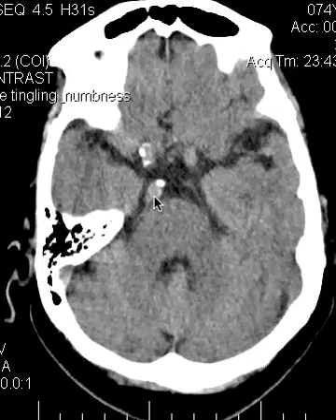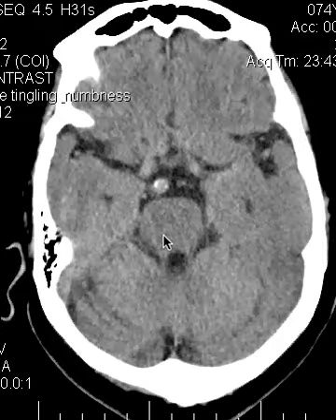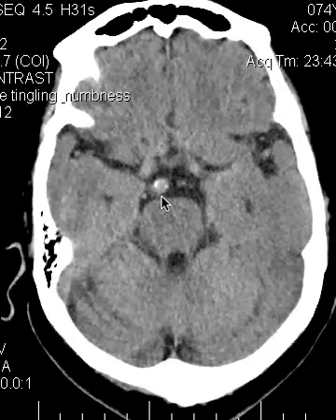So what we have here is a very tortuous basilar artery that's swinging around, and in the process of being very tortuous like that, is swinging over to the right side and encroaching exactly on where we expect to see the trigeminal nerve. Now, even though the trigeminal nerve is rather large, it's hard to see on CT. You have to catch it exactly. But certainly, we know that it's going to be right around here. And it may be even part of that little line that we're seeing there, diving forward and inferiorly toward Meckel's cave. Remember, Meckel's cave is where the trigeminal or Gasserian ganglion is located.